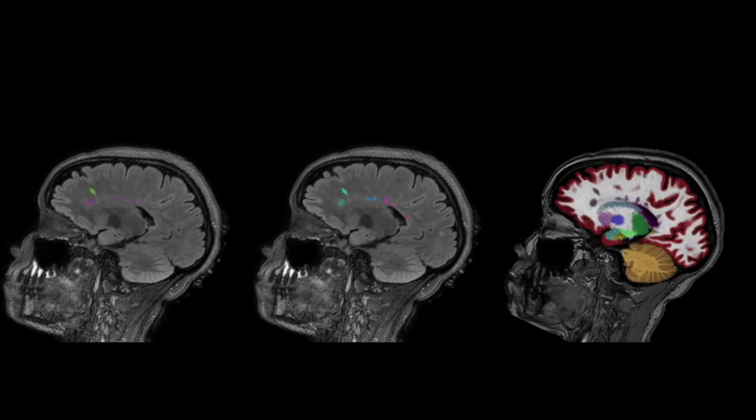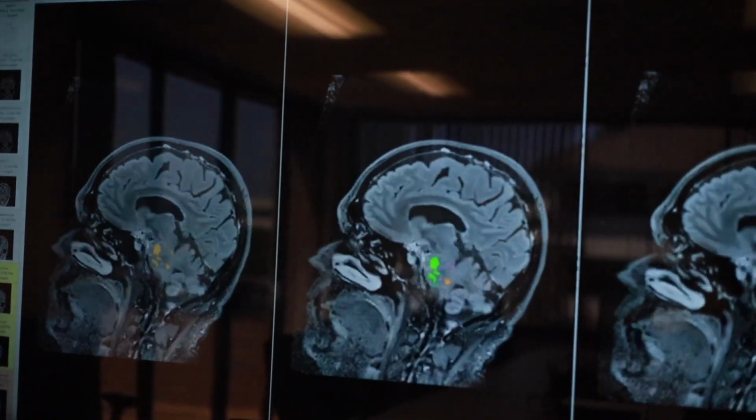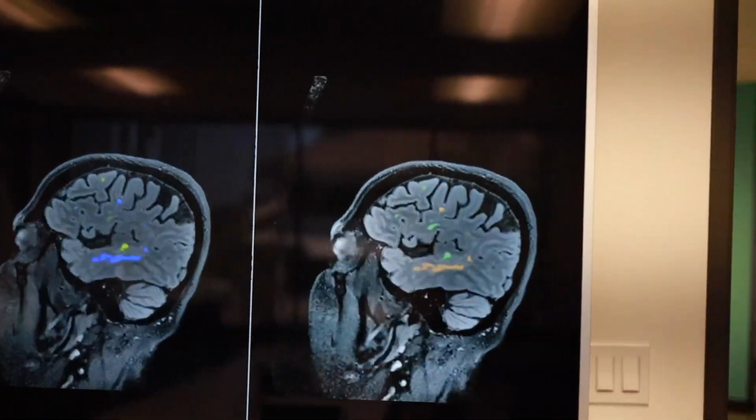And then, very importantly, it will incorporate the prior study. MS patients tend to get scanned once a year. It will incorporate the prior study, and calculate lesion dynamic change over time. It will tell you the number of plaques that are increasing in size and number, what's new, what's shrinking, and what's staying stable. This is an extremely useful tool, because if a patient only has a few plaques in the brain, it's very easy visually to see what's different from the prior study. But if they have a moderate or severe plaque burden, which most MS patients do over time, it becomes very difficult because of differences in slice sampling and head angulation.